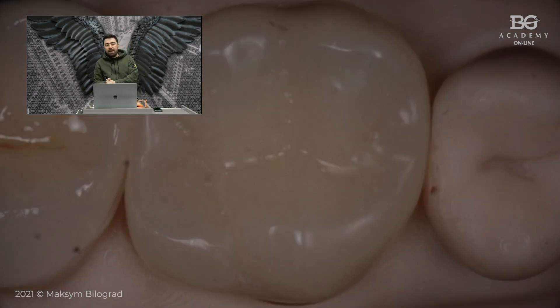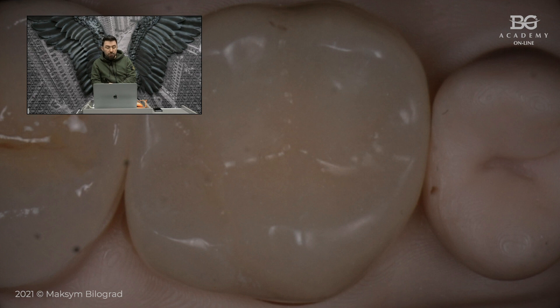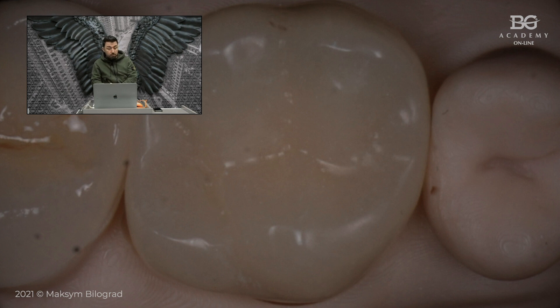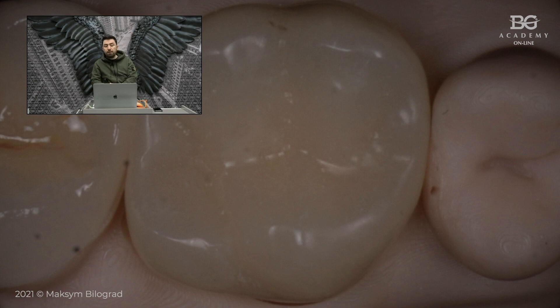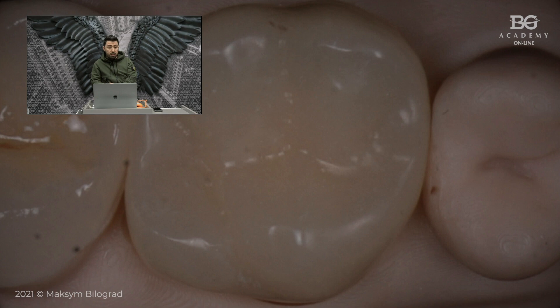We made a PMMA crown — a milled PMMA temporary crown — because the prognosis of the endodontic re-treatment was not perfect. So we decided to do a PMMA crown for three months. I cemented this crown with polycarboxylate cement. After three months we will make another examination, and if everything is all right we will replace this PMMA crown with the final one. If you use this approach for temporary crowns, you have to prep well, isolate well, retract well, and take a good impression so the provisional crown is perfectly fitted on the tooth structure — that will guarantee a good result.